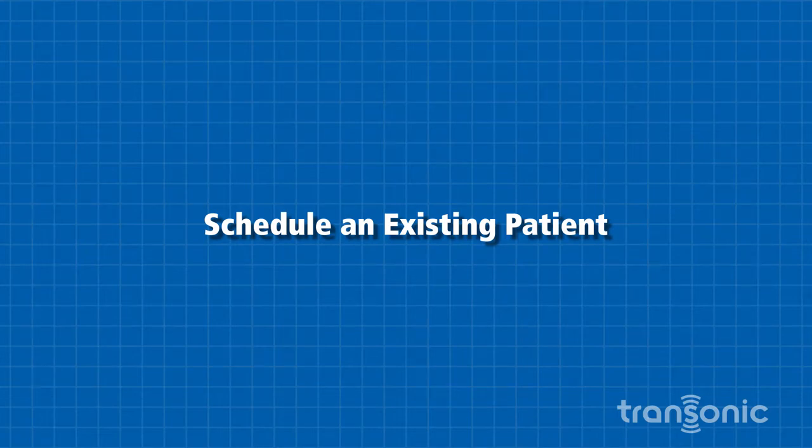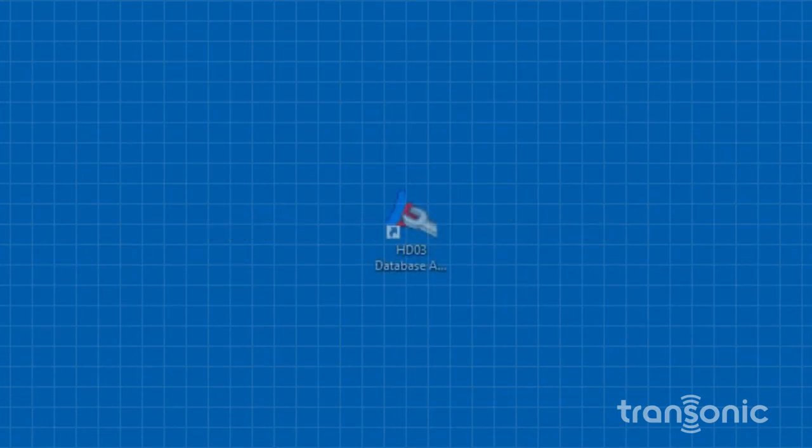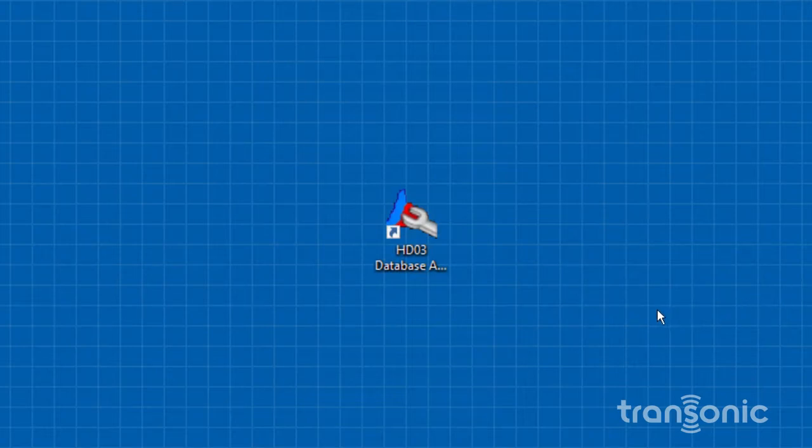Follow these steps to schedule an existing patient. Open the HD03 Database Administrator software.